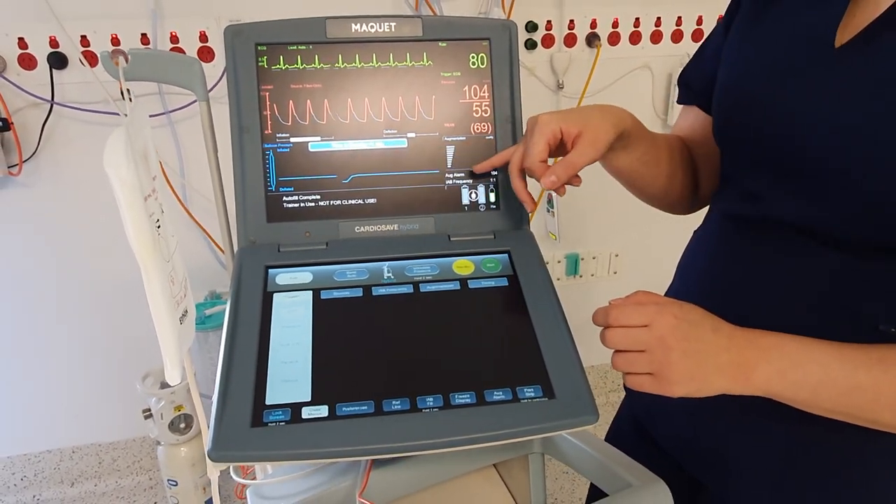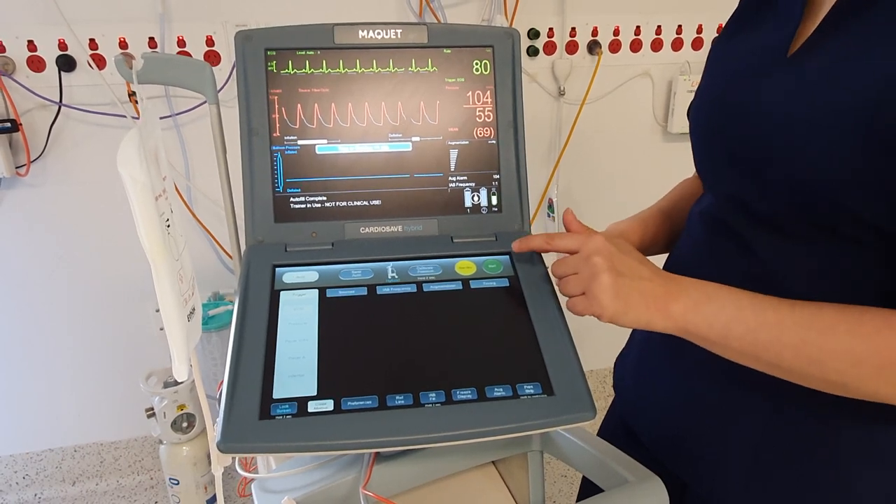When you do this, the balloon pump goes into standby, so always remember to hit start — the big green button here.